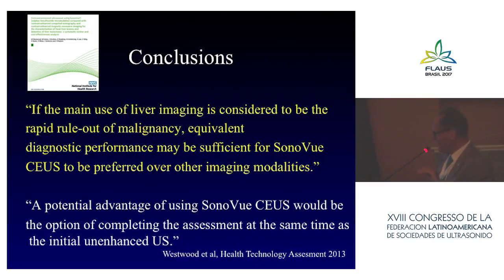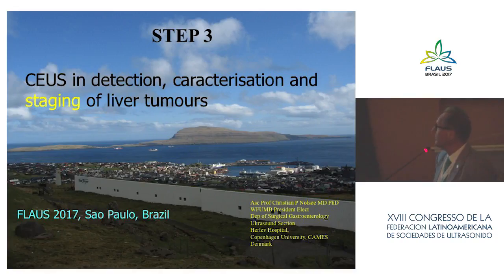And they also say, and this is very important, a potential advantage of using SonoVue CEUS would be the option of completing the assessment at the same time as the initial study. In other words, if you refer a patient for CT and MRI, when do you get the answer? Well, if you're the radiologist, you have the answer immediately. But if you're the referring doctor, you might have to wait 1 or 2 weeks because it takes some time. But if you get the ultrasound study, you have the diagnosis immediately after.